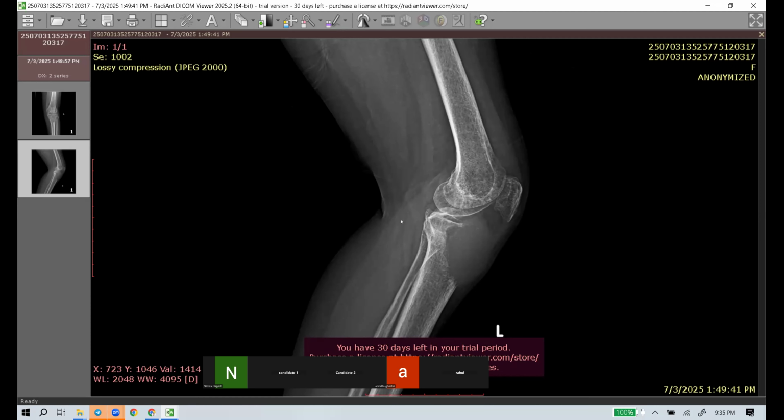So in a 50-year-old patient who presents with a large lytic lesion in the proximal tibia, I would like to think in terms of any metastasis, whether the patient has any previous history of any malignancy or any recent surgery. And I would like to compare the radiograph with the prior imaging if available. And I will inform the findings to the treating physician, and the patient needs further urgent referral for further workup. Okay. So where would you refer this case? I would refer the case to bone MDTs. Bone MDT. Okay.